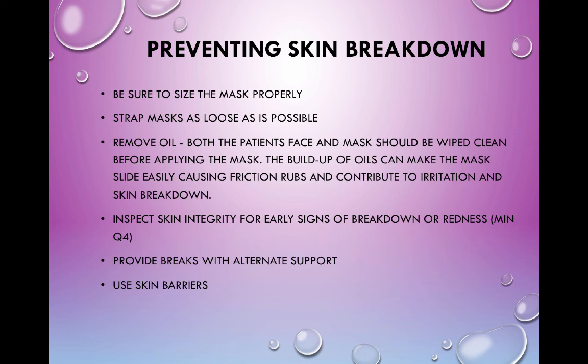We have other things to support them with, high flow nasal cannula, things like that to give them a little break. So we want to try to convince the doctors, you know what, continuous is good, but breaks are better. So we should try to take them off for a little bit, even if it's for an hour. Give them a little bit of a break, give the skin a little bit of rest. We can try different masks, so we have different pressure points. We have skin barriers too.